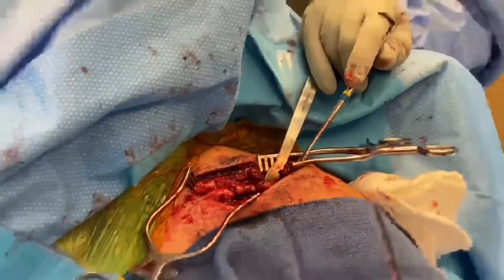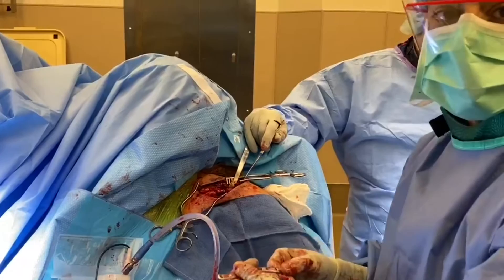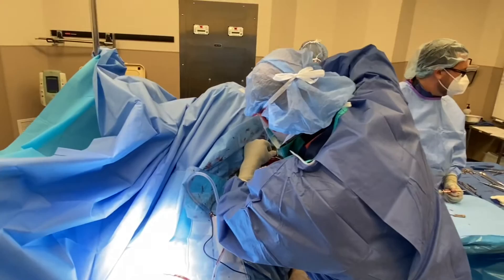This fracture is very comminuted, or basically crushed, so sometimes it doesn't fit very well. I think we've picked out the plate that we're going to use here — it's an Arthrax stainless steel plate. We want to get at least three screws on either side of the fracture.